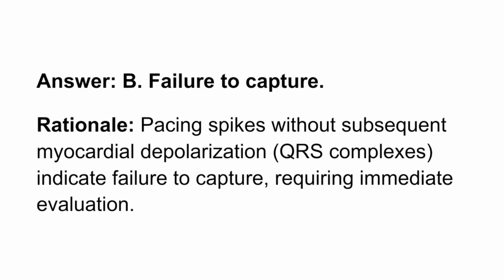Failure to capture. Rationale: pacing spikes without subsequent myocardial depolarization, QRS complexes, indicate failure to capture, requiring immediate evaluation.